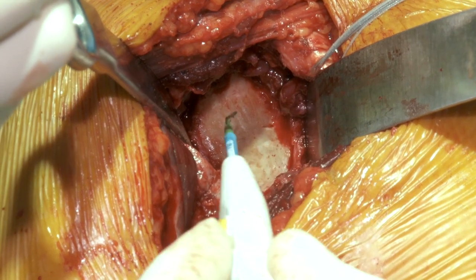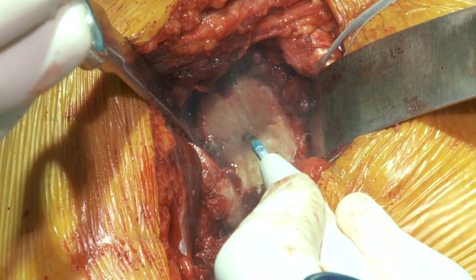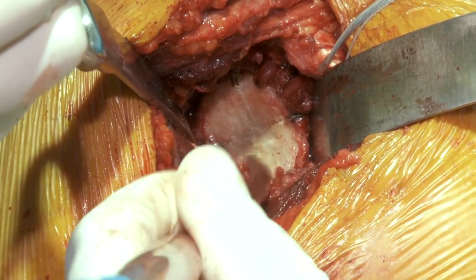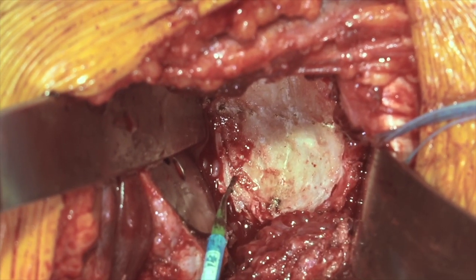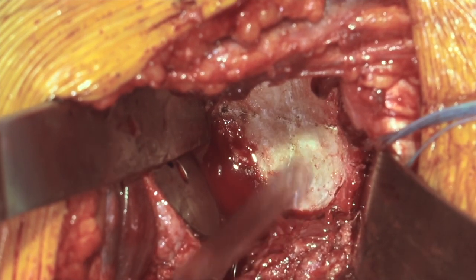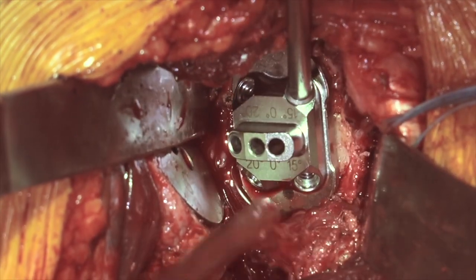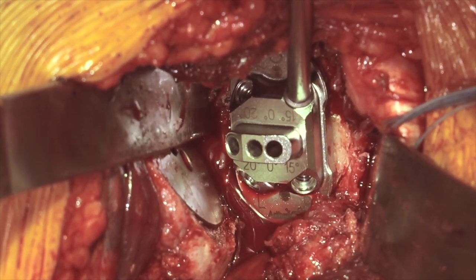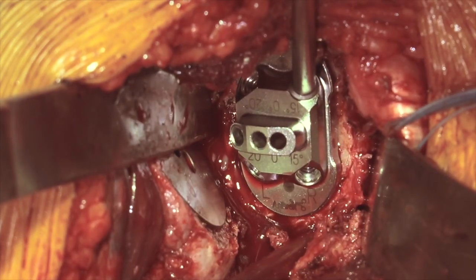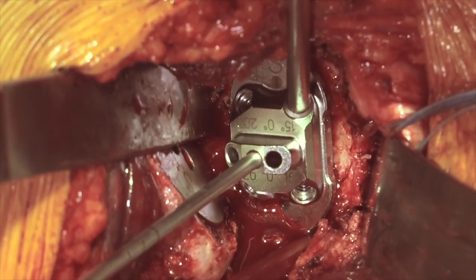We can tell from our preoperative x-rays that the version for this patient looks to be within normative data. We don't have any significant erosions. We're going to identify the superior-to-inferior and anterior-to-posterior plane and know this is our center line. With the reverse prosthesis, what we're primarily interested in is the curvature and diameter of the inferior part of the glenoid, and we'll look at the center of that where we're going to place our small glenoid component. We'll position the small glenoid component to line up just at the inferior edge, avoiding superior tilt — neutral or inferior tilt is what we're aiming for.